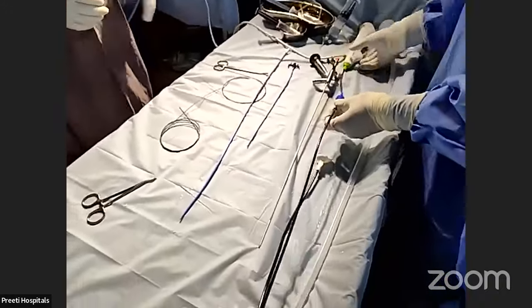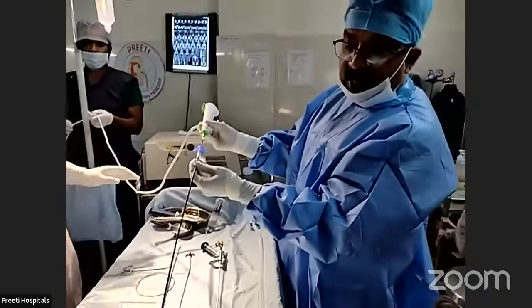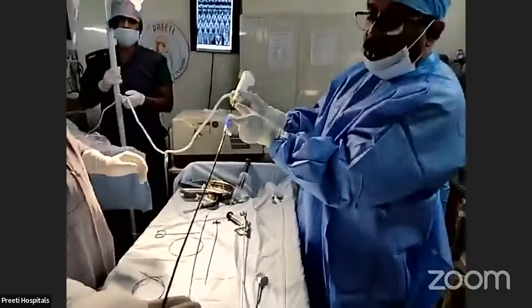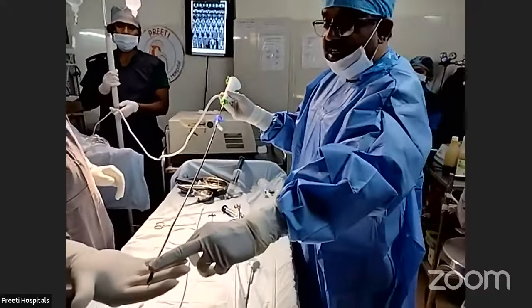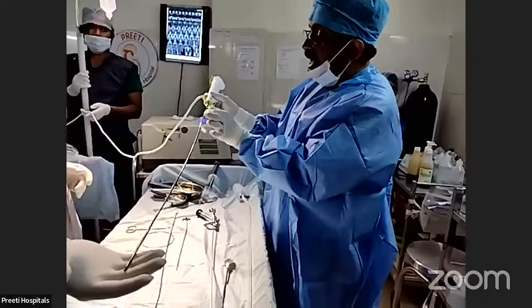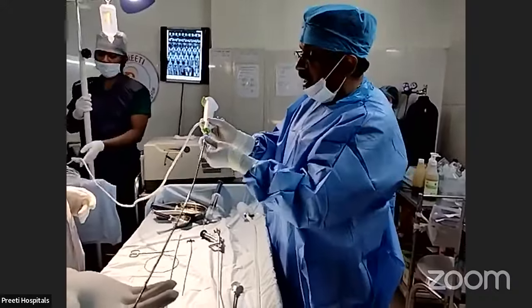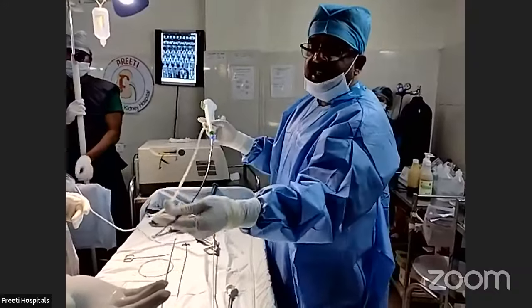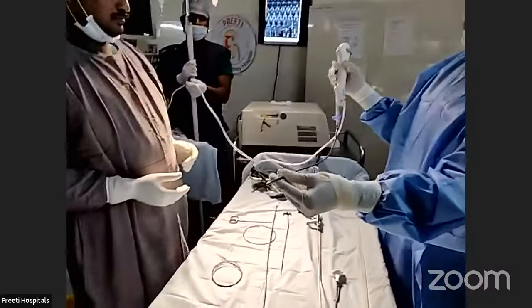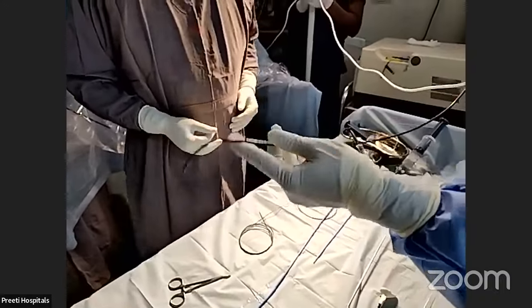And when you go, see, the most important point I want to observe is that when it comes out, this much length is only there. This length is 45, 50 centimeters, 50. So only 55 centimeters this, sir. If you take more than that, it will come nearer and you cannot do movement. See, this much is inside. This much is inside. See, now it is moving. Last 15 centimeters should be outside.